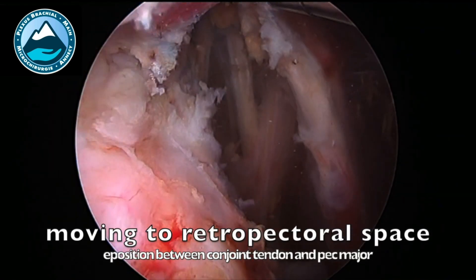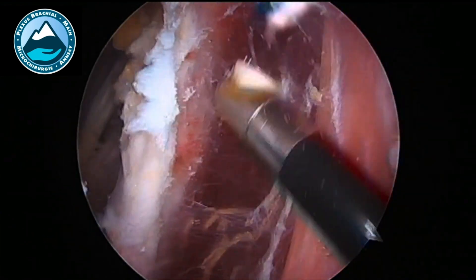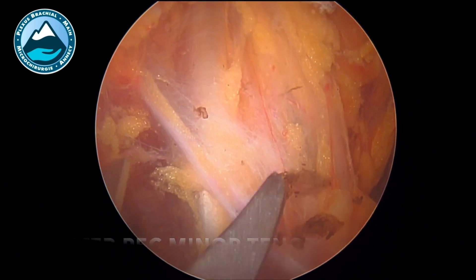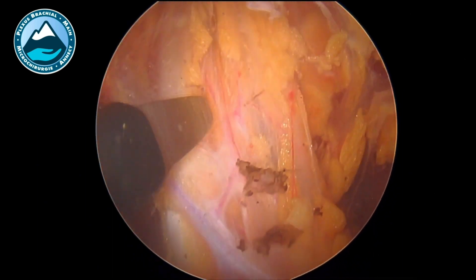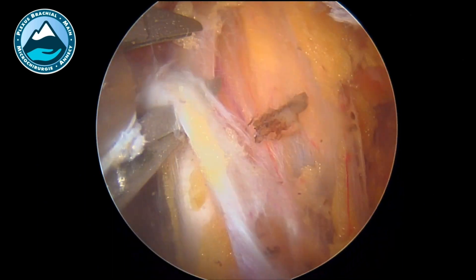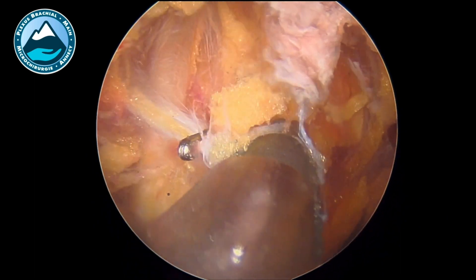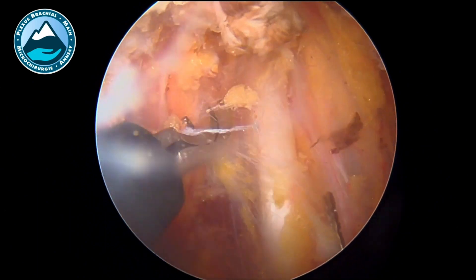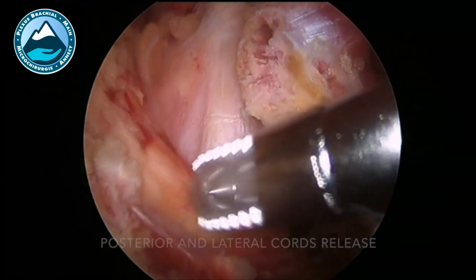Once the retrocoracoid dissection is complete, we will move to the retropectoral space and then work in front of the coracoid. What's different now from before is that I like to use endoscopic scissors for the dissection. When there are bands and fibrous tissue, I like to do ligatures and use clips. I can cut all the fibrous bands and vessels with those scissors.